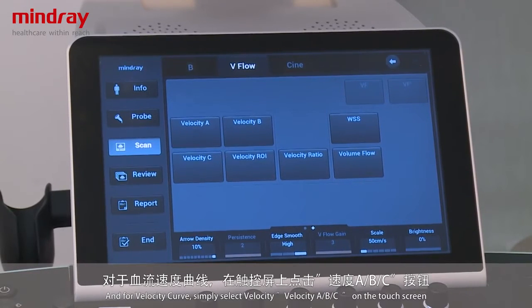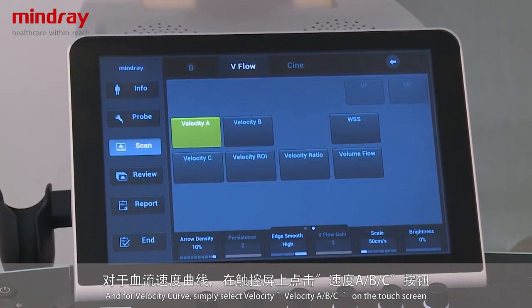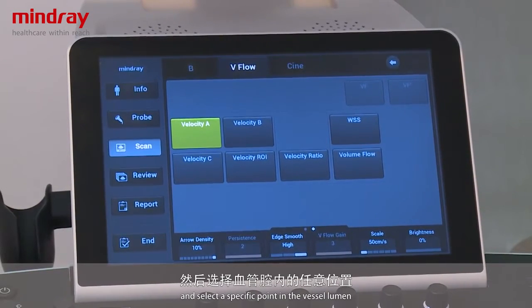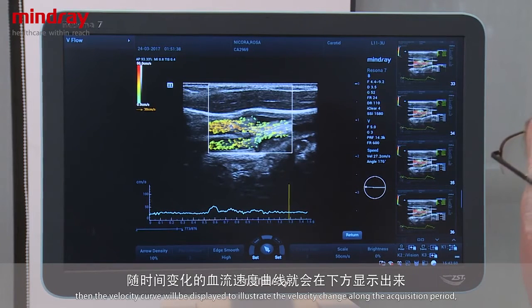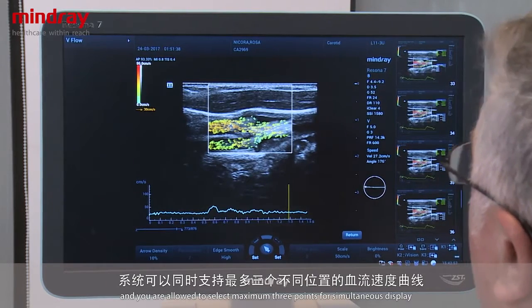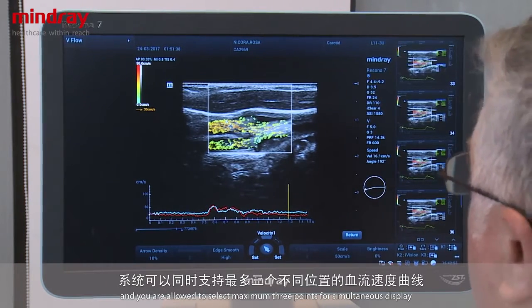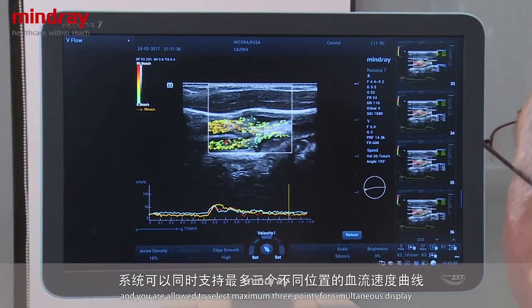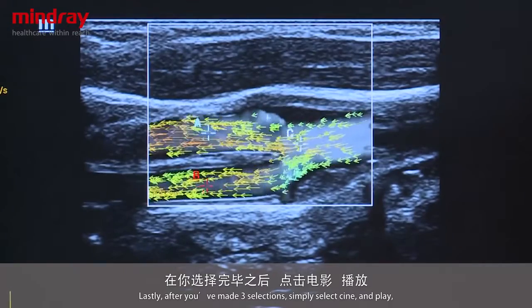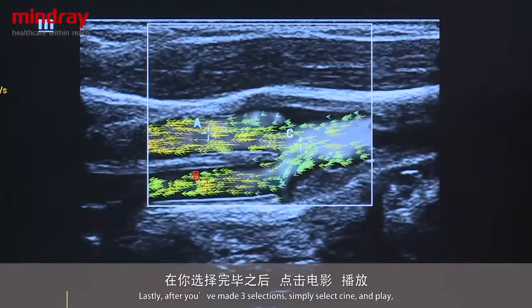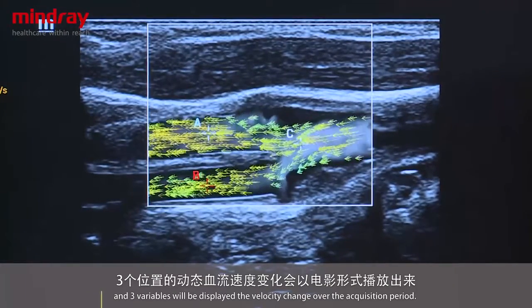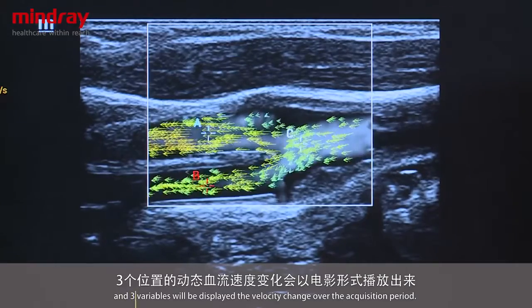For velocity curves, press velocity A, B, or C on the touch screen, then select a specific point within the vessel lumen. The velocity curve will be displayed to illustrate the velocity change over the acquisition period. Up to three points can be displayed simultaneously. After making your three selections, select cine and play, and the velocity change for all three variables will be shown over the acquisition period.